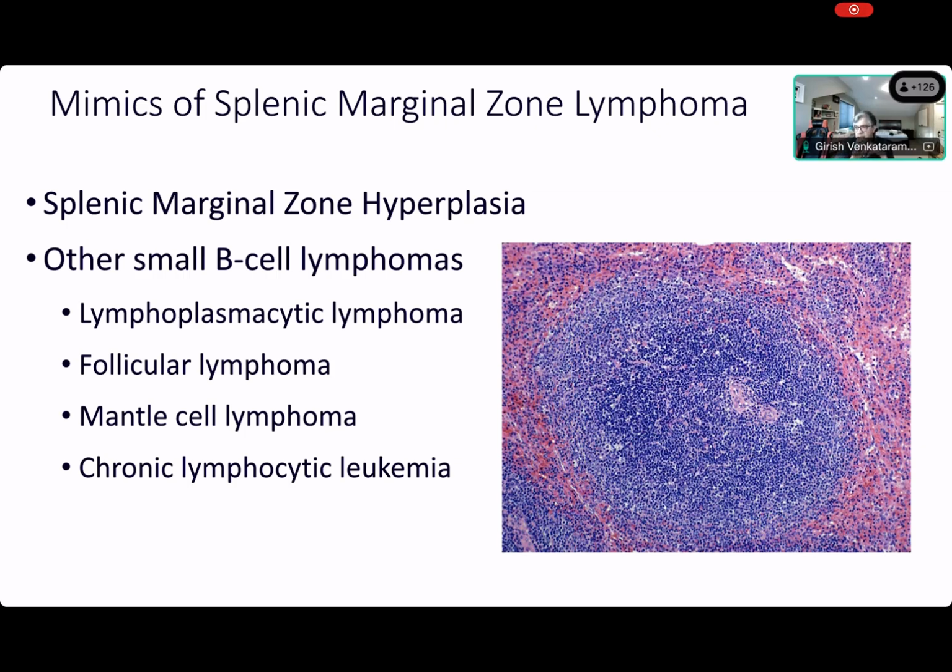That's about the only thing I can say. And the only thing I can say looking at the white pulp is it looks like the tripartite distinction is dissolved. So this could be anything, right? It could be follicular lymphoma. It could even be a CLL for that matter, but CLL presenting as a primary nodule in the white pulp, it could still be a marginal zone lymphoma. That would be my differential there.